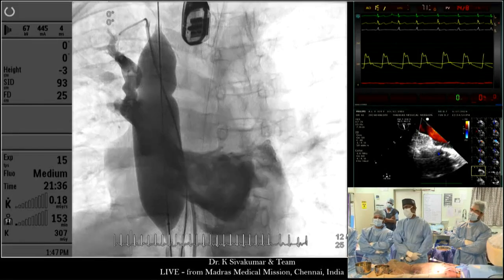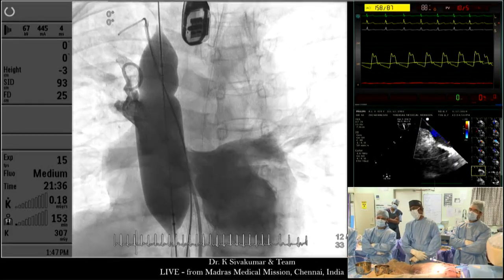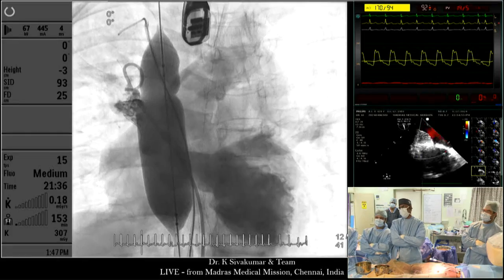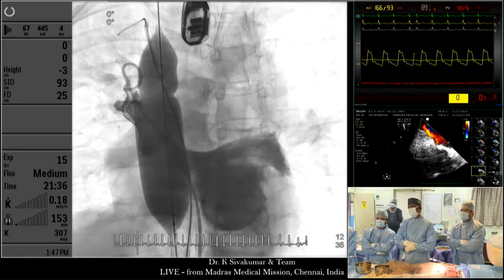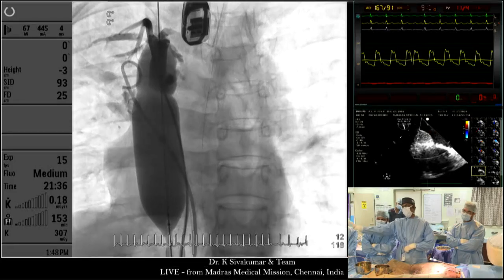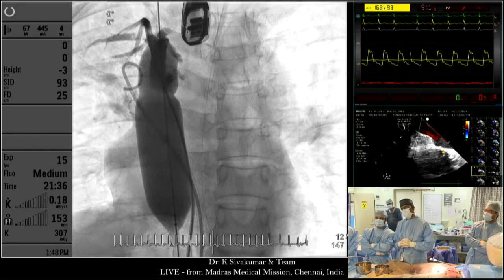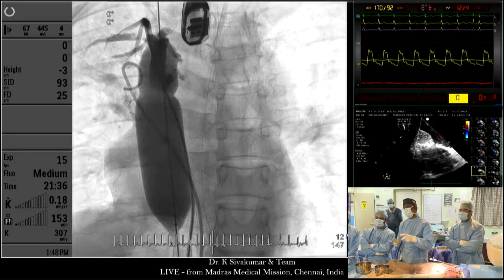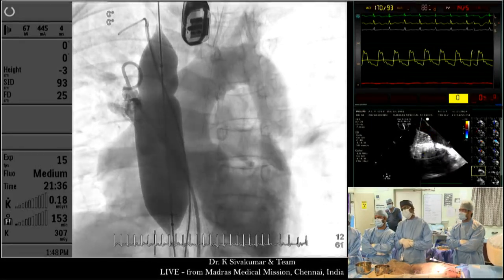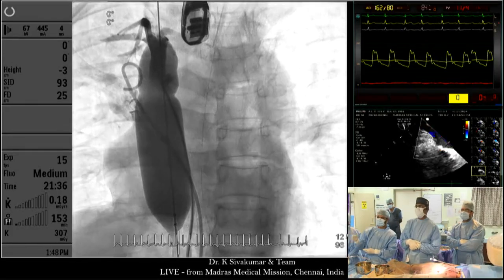Go further, go further. So we can see the full left atrium getting filled, left pulmonary veins getting filled. There is no residual flow into the right atrium at this point. Now LV and aorta keep filling, keep running. Towards the end of this injection, I inject into that additional pulmonary vein, freeze. So this additional right pulmonary vein is getting occluded by this balloon, and as I deflate the balloon, keep going, we can see that that pulmonary vein now drains into the superior vena cava. Keep running.